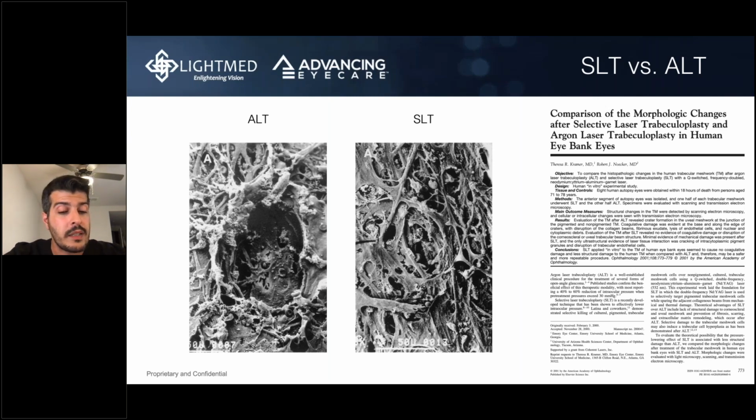They might still not feel it depending on the energy setting you have, but that's when people say, yeah, I could tell. They still wouldn't say pain, but they would say, I could tell something was being done every time you hit the laser. I could feel something in my eye. And then obviously, that's number one. Number two, you shouldn't expect any IOP effect, obviously.